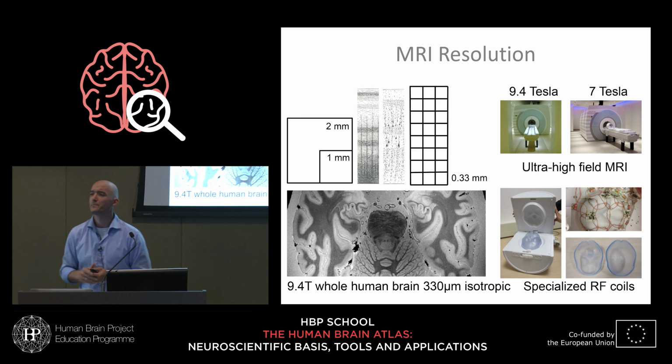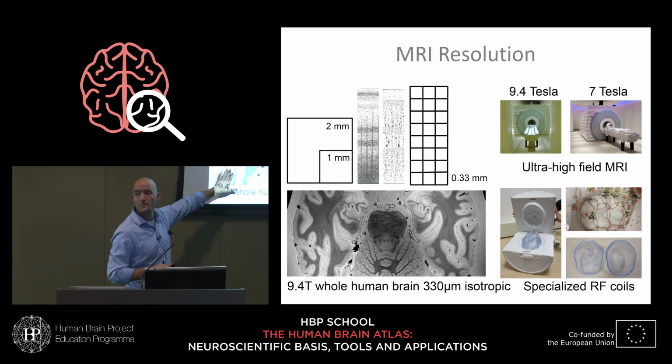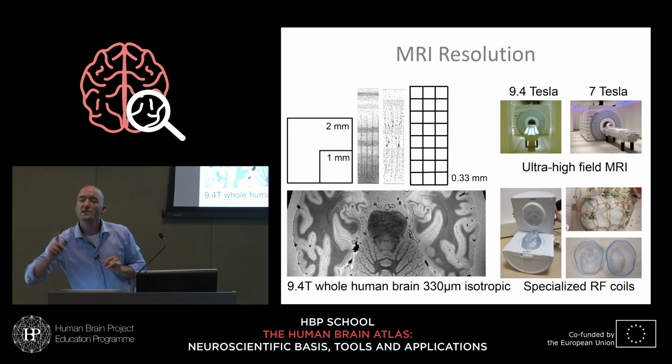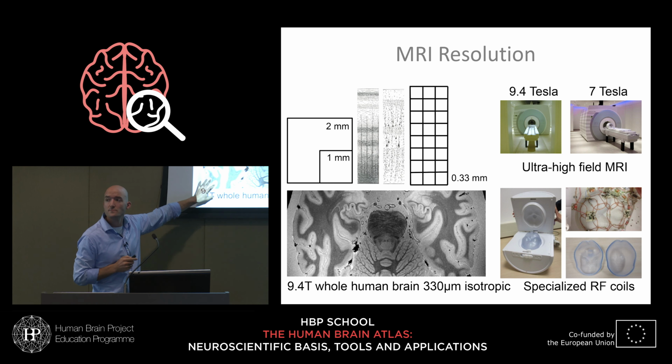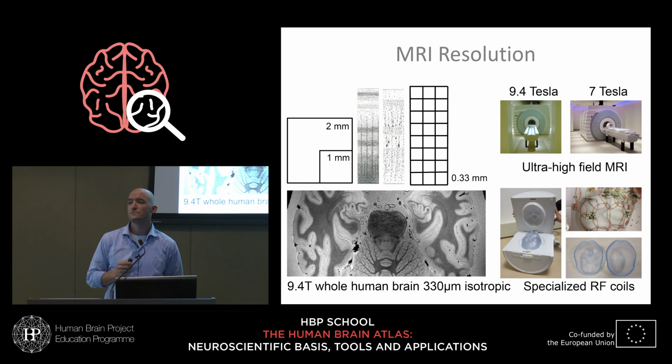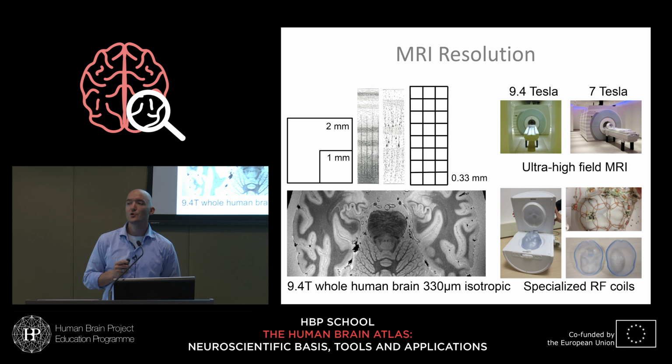Yes. So actually, is this image on the left after tuned preprocessing? I didn't quite hear your question. Is this image on the left raw data, or is it after preprocessing? Because we have some noise components that you have to handle. Like in 3 Tesla scanners, you have totally different filters to filter structural data and diffusion data. So the noise distribution changes. Like if you have parallel MRI acquisition, it gives you a totally different noise distribution. Yeah, good question.